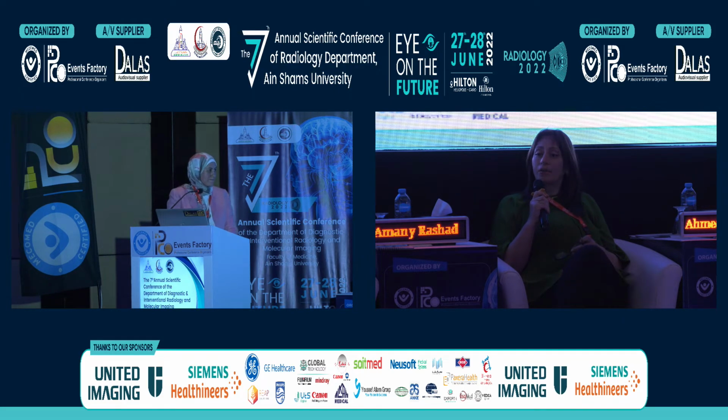Which brings me to the other question: we usually use cross-sectional imaging for staging rather than diagnosis. You use the cystoscopy and biopsy for diagnosis, and then they come back for the cross-sectional imaging, CT. Where is the role of CT in this part? Once you do the MRI and you have diagnosed, you don't need CT?